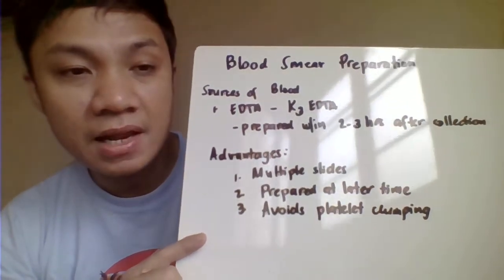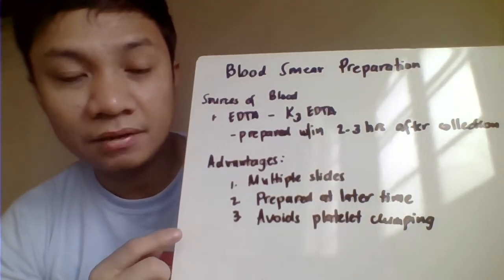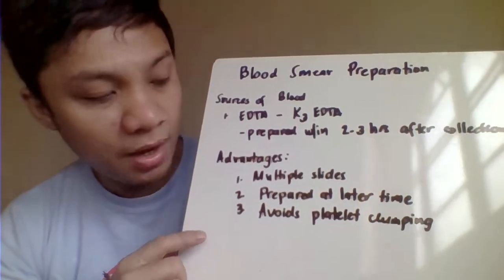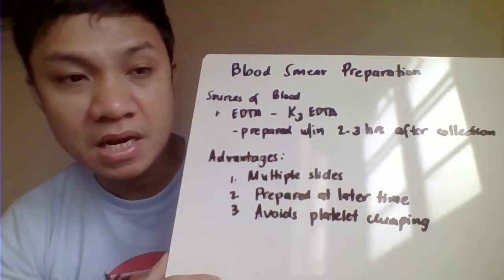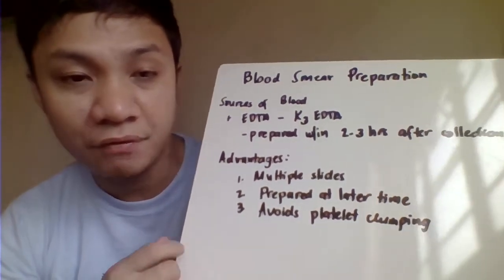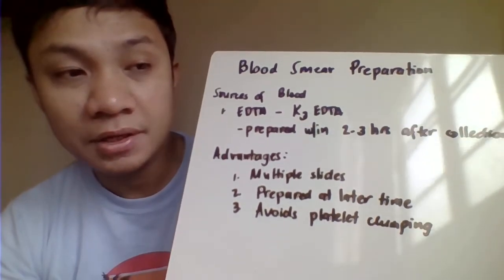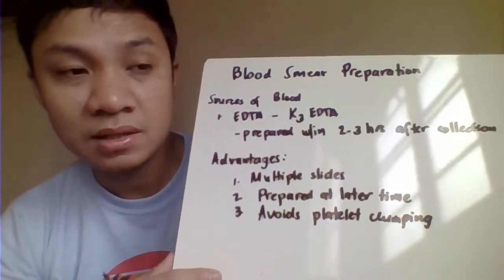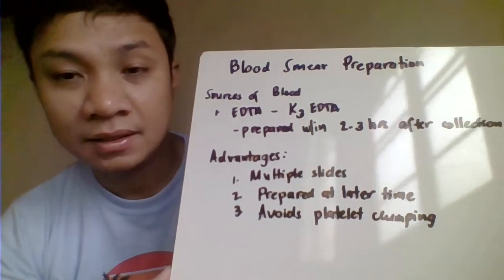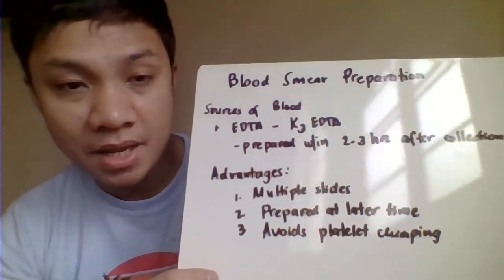We have several advantages of blood collected in EDTA. Since it contains an anticoagulant, number one, you are able to prepare several smears since it is not clotted blood, so you can have your trial and error. Another one, you can prepare the smear at a later time, because the blood is not clotted. And another one, it could also prevent platelet clumping.